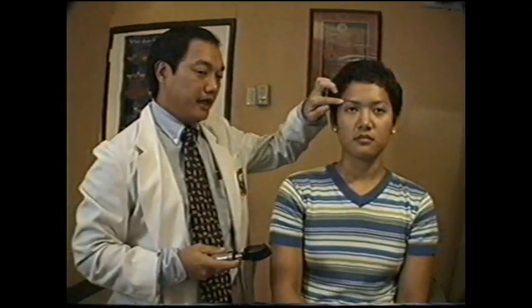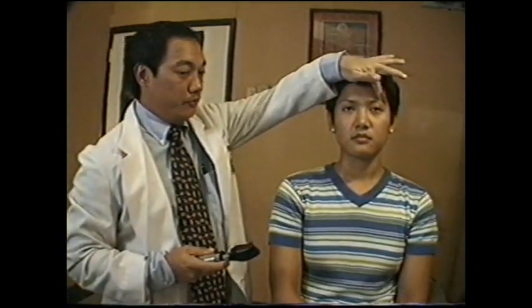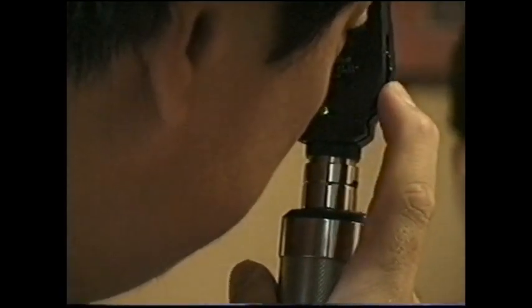The examiner examines the patient's right eye with his own right eye and the patient's left eye with his own left eye. The ophthalmoscope is held in the corresponding hand. The examiner sits or stands on the side of the eye being examined. The head of the ophthalmoscope is steadied on the medial superior margin of the examiner's bony orbit. The examiner's index finger is used to change lenses.